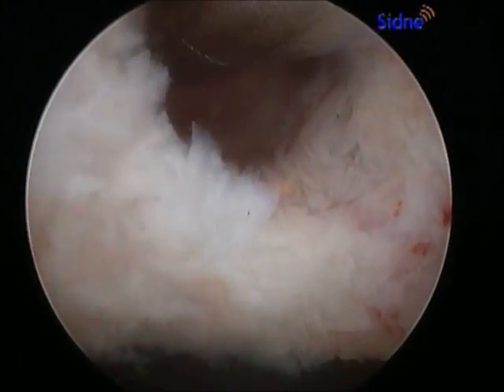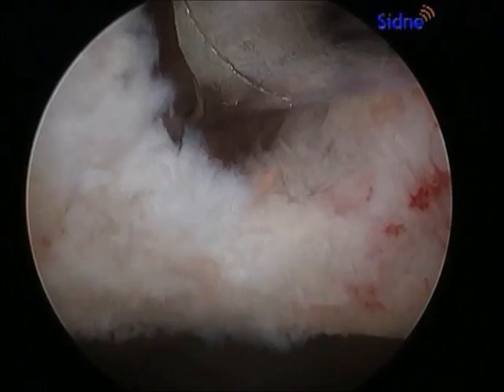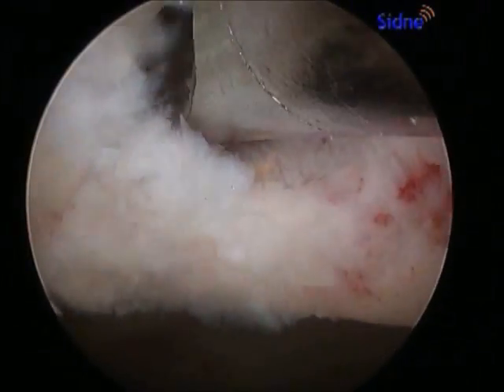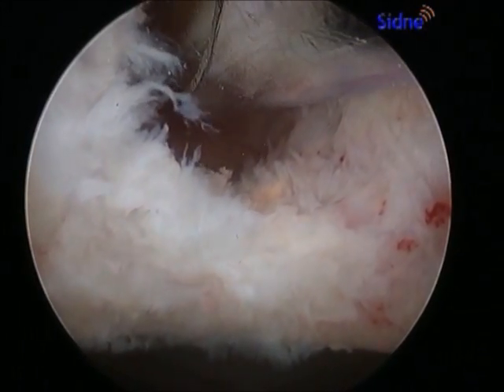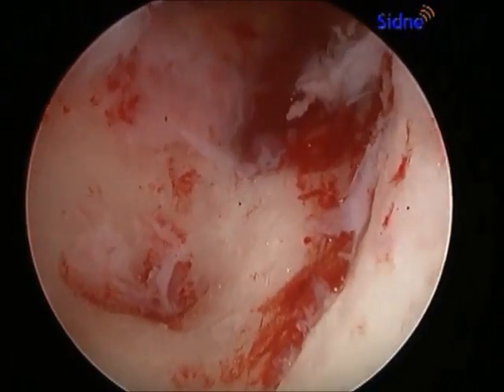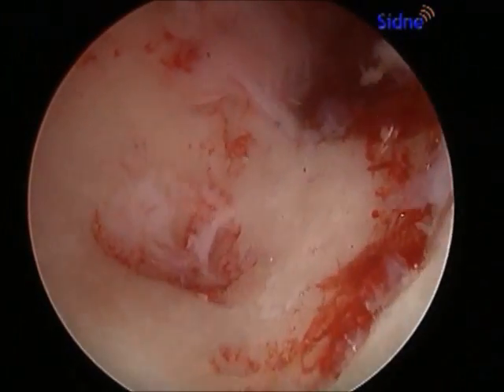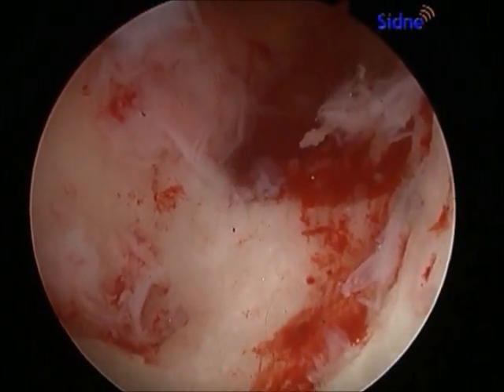The curette is used to remove the cystic material and the shaver also continues to remove any soft tissue remnant in the top of the acetabulum. Once the soft tissue has been removed, the arthroscope can actually be inserted into the cystic cavity, showing this large opening where there should be complete filling of bone.